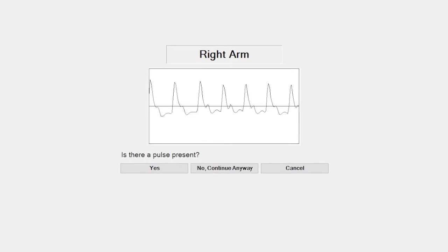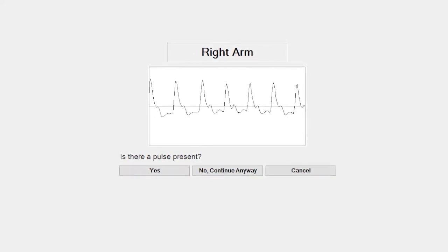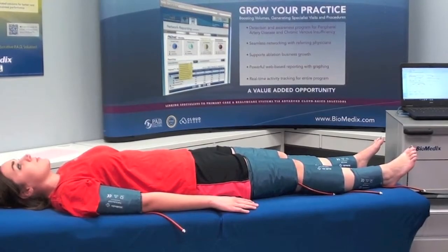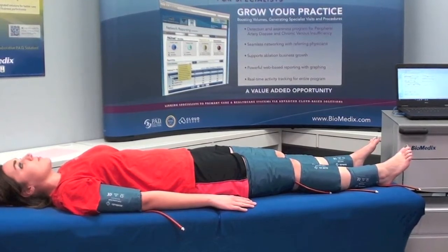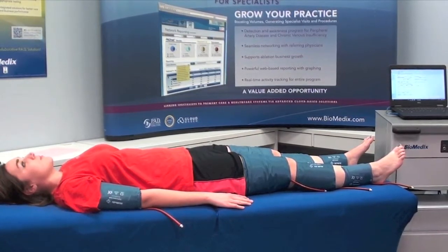For arm pressures, the system will first display a reading from the PPG probe on the right finger and ask you to confirm a pulse. If you do not have a PPG probe, you may skip the affected portions of this test. Upon confirmation, the system will record the air pressure for this location using air cuff technology. During the exam, ask the patient to lie still and keep conversation to a minimum. Test measurements that have been affected by patient movement are usually not acceptable to send for interpretation.